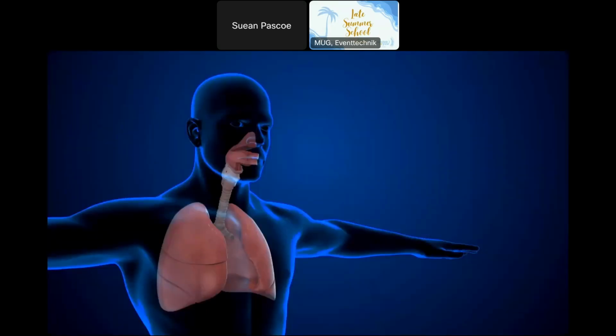Now, the reason we put the probe in the longitudinal position is so that the rib is round and not mistaken for the pleural line. If we put it in the transverse, you can see the pleural line is reflective with reverberation and grey behind it. And if we were on top of the rib, it is highly reflective with shadowing behind it. And when you're in a hurry, you don't want to mix up those two things. So we put the probe on in the longitudinal orientation because the ribs are round and very easy to identify.